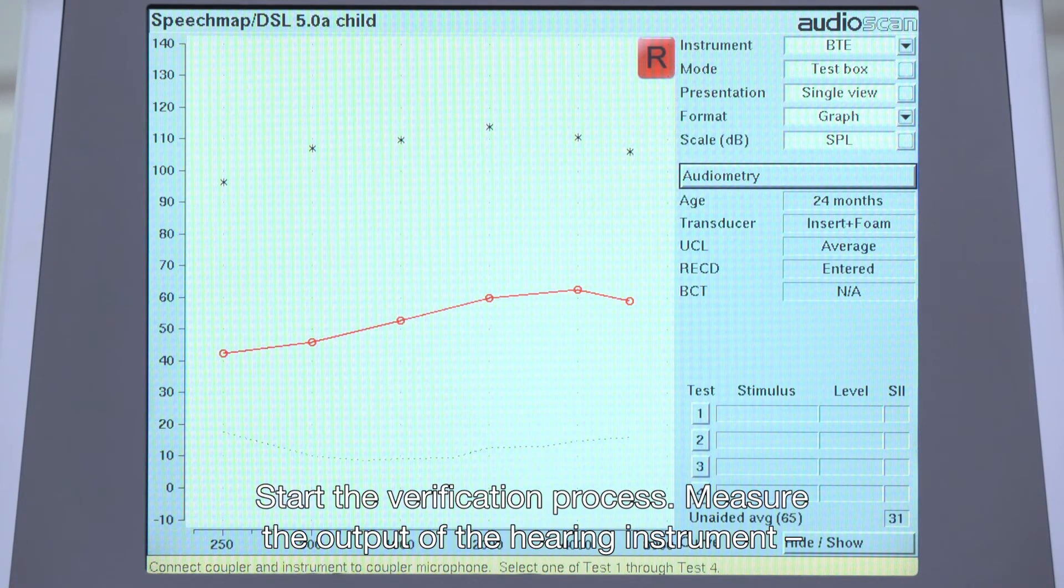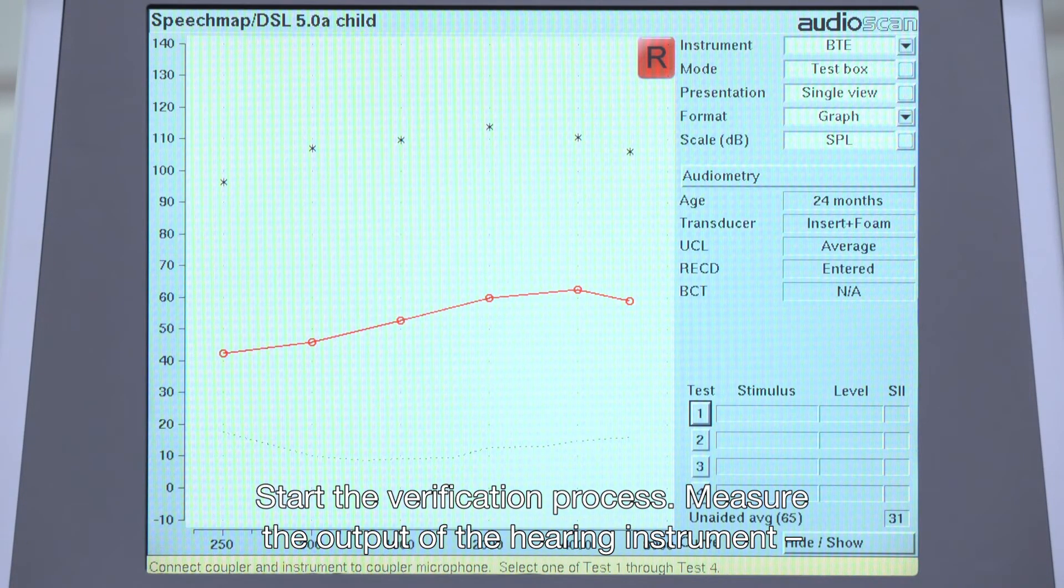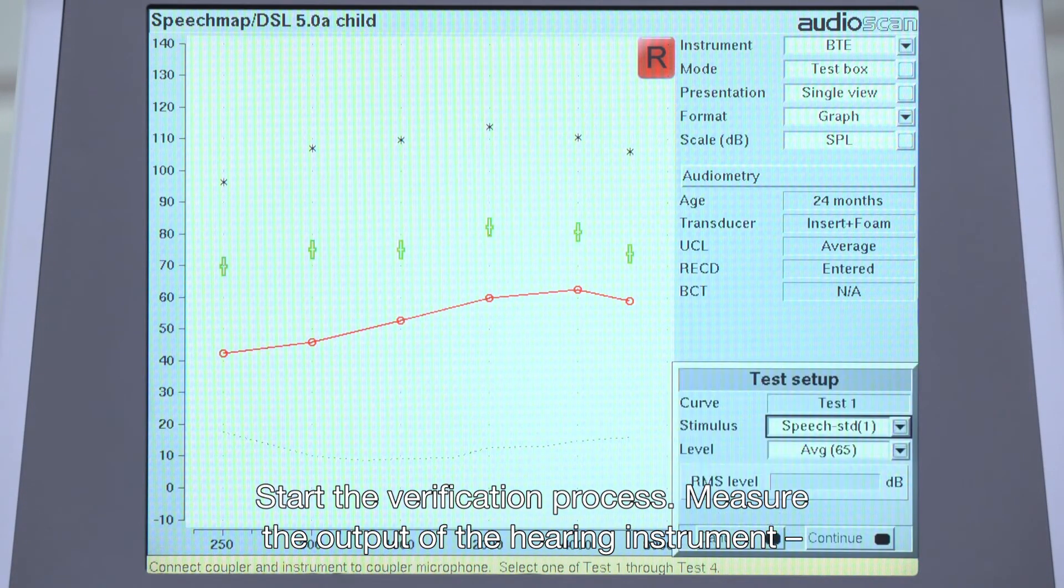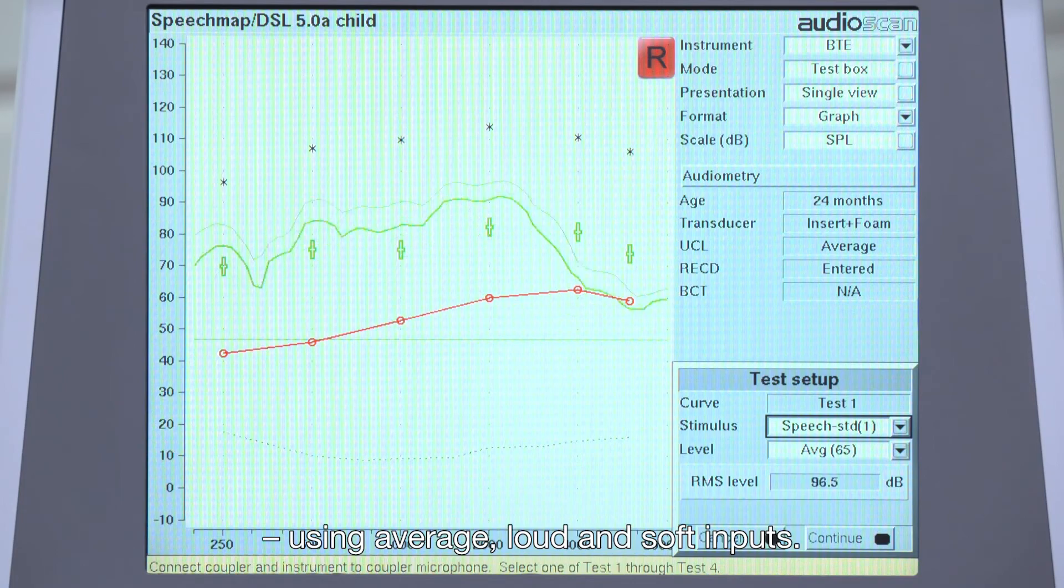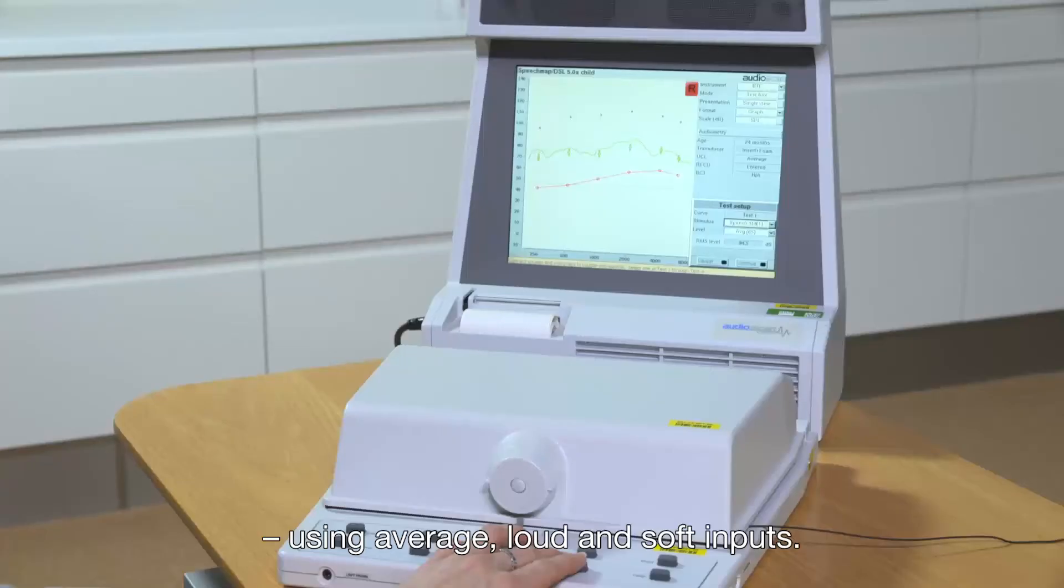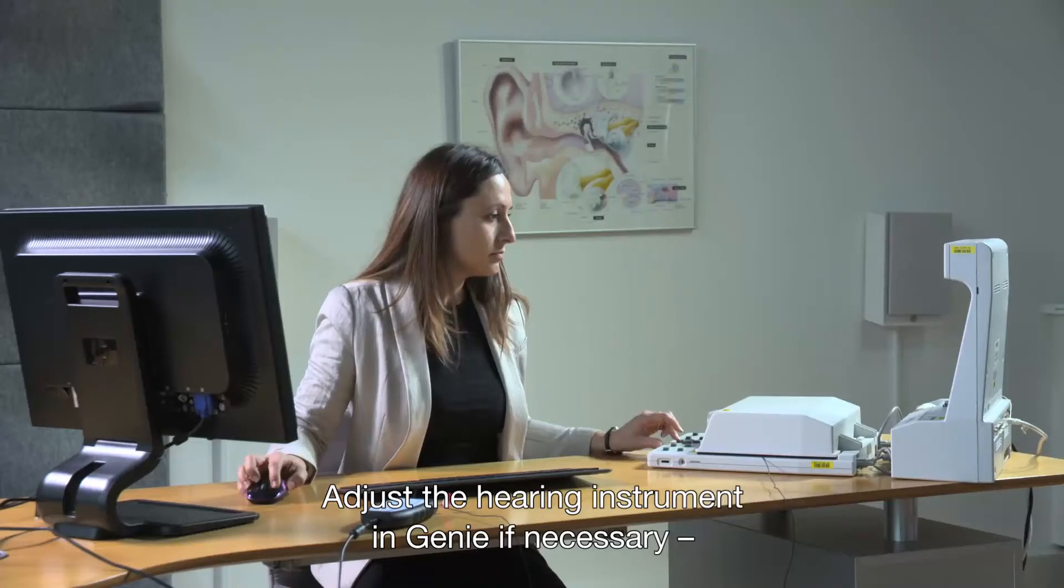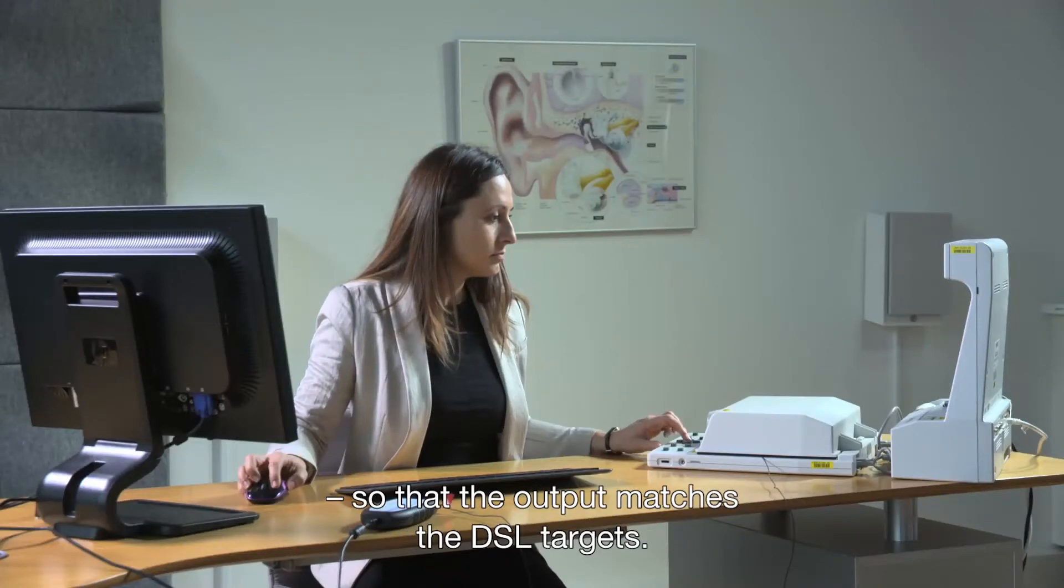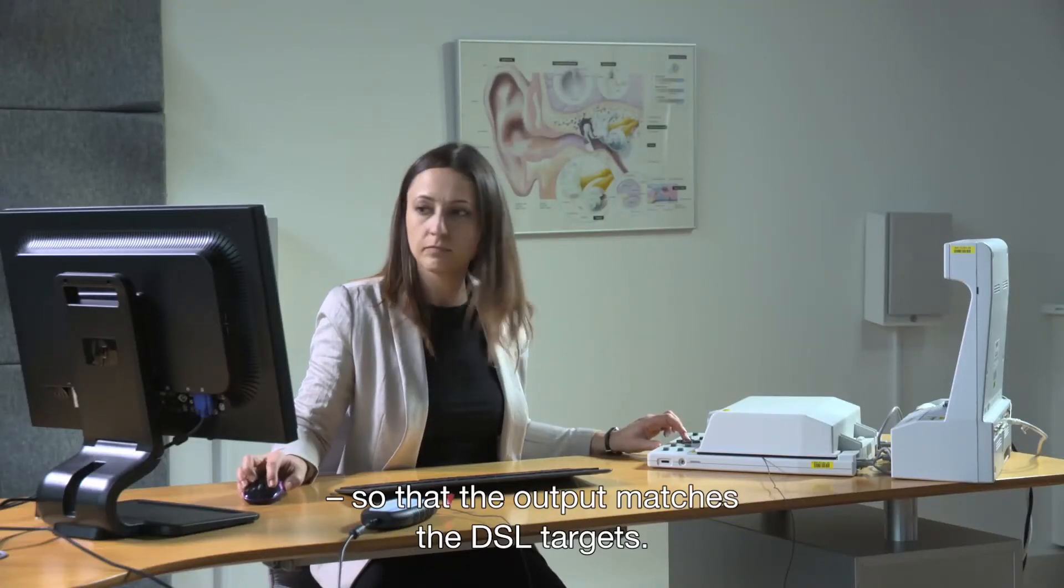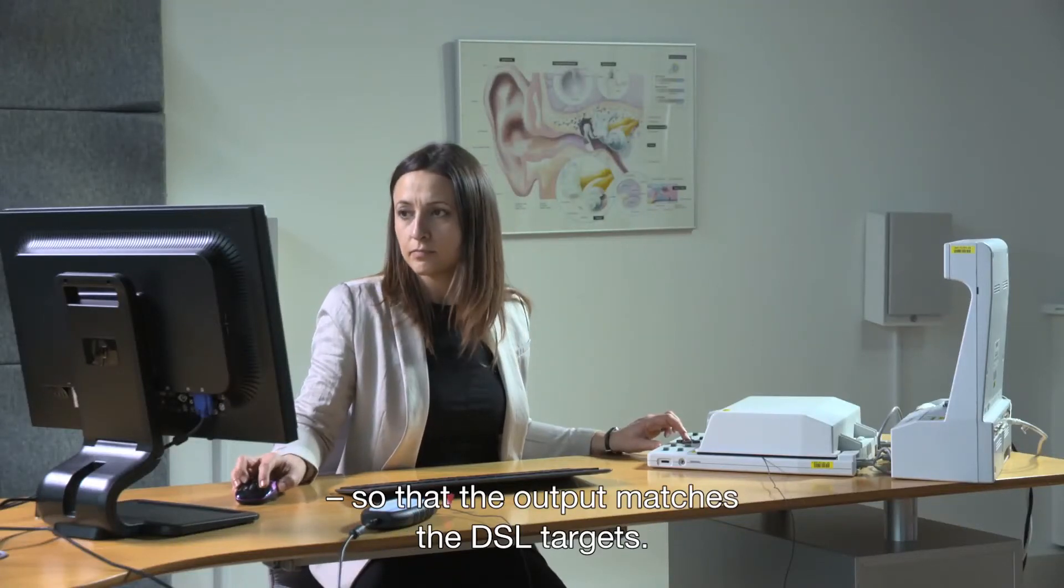UCLs are also automatically predicted when using the DSL fitting rationale and will also be displayed on the screen. Next, ensure that the same measured RECD values that were used in Gini are also entered in the Verifit. Start the verification process. Measure the output of the hearing instrument using average, loud, and soft inputs. Adjust the hearing instruments in Gini if necessary so that the output matches the DSL targets.